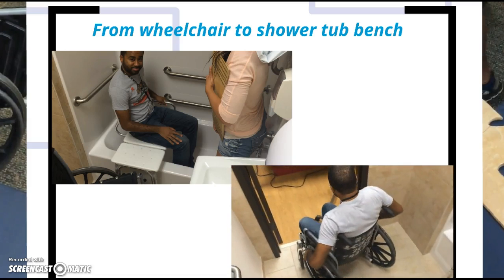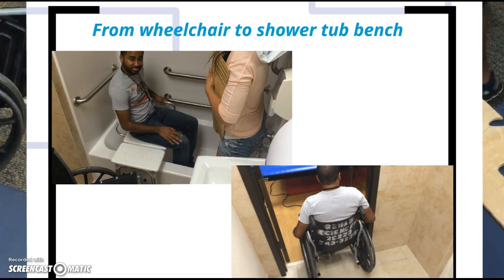As I said before, we need to keep in mind that not all patients will be this easy. Jordan was helping me quite a bit with his arms and with his legs, lifting them up out of the shower. So a couple things to remember is we need to count to 3 and let them know when to help lift up and scooch towards the desired destination. Also, we need to support with our knees on the patient's knees. We also need to have good mobility for the patient, so keeping their spine erect and their posture good, while also maintaining good mobility for ourselves, the therapist, as well.